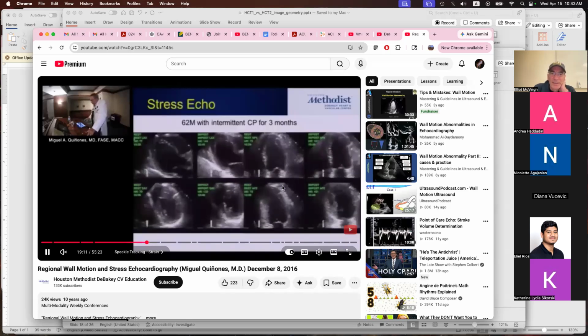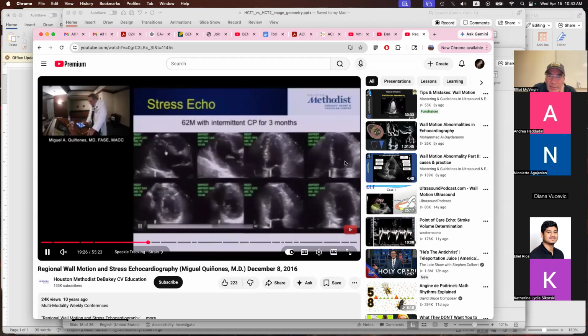Right. So this is halfway. We've put drugs in and we're getting this kind of contraction here. And then we put more and this happens. Right. So you can see this, even though these images are blurry, in the movie, it's absolutely obvious that the septum stopped contracting, right?